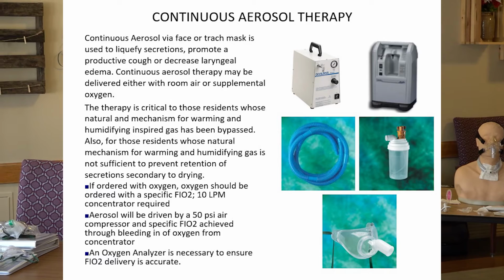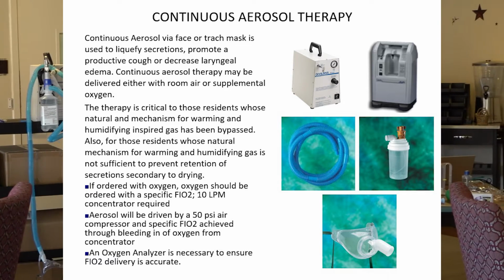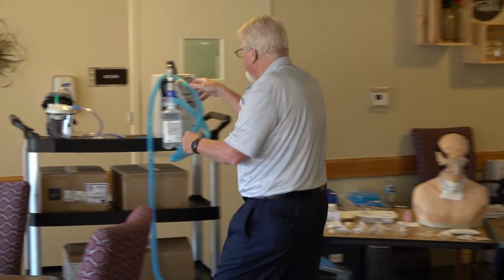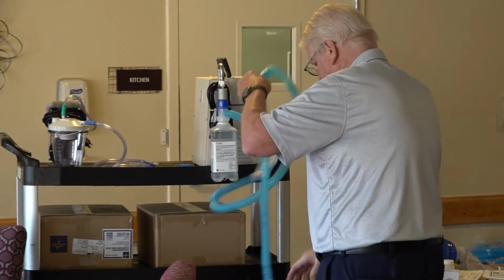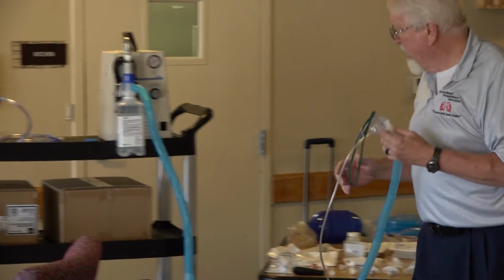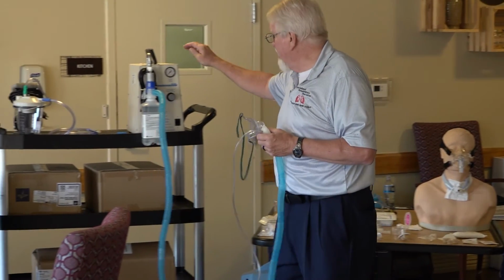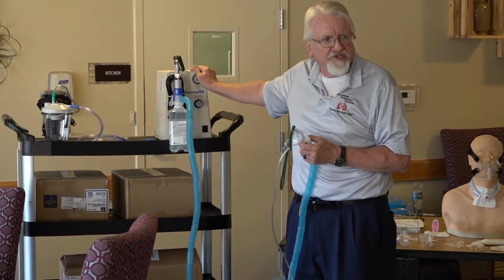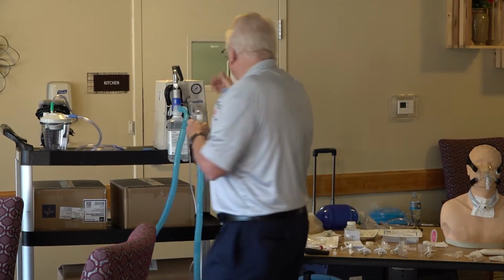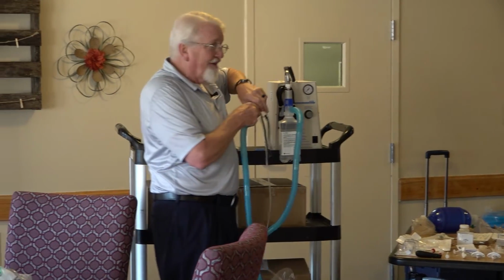All right, let's see. So now we're going to go over the aerosol therapy. I know you folks have seen all this stuff at one point in time or another. So I guess we'll just start at the compressor. So sometimes the doctors will actually write the compression setting that they want. It's kind of a 50-50, depends on the doctor. But anywhere usually between 20 and 30 is adequate.